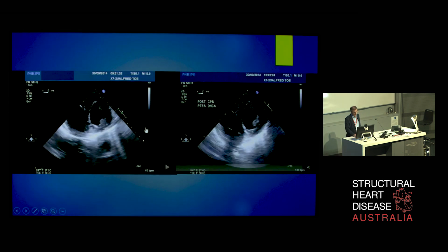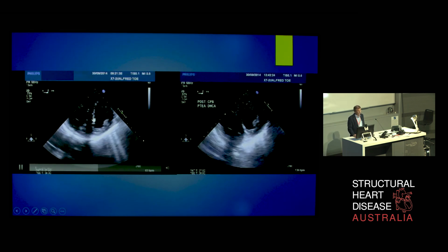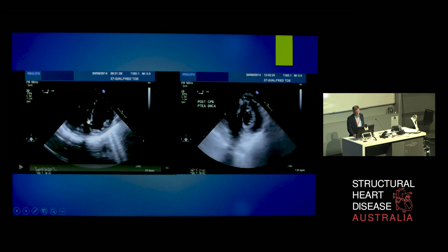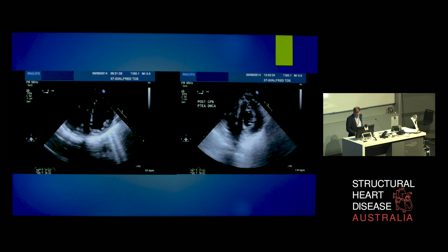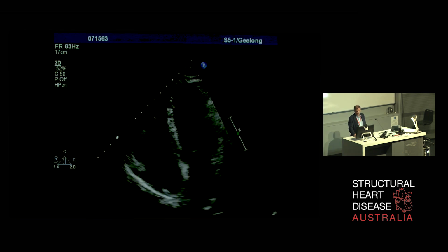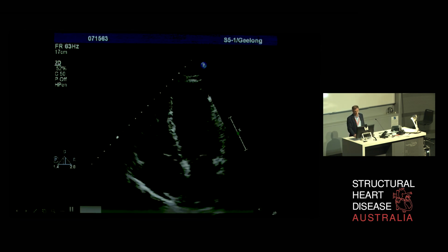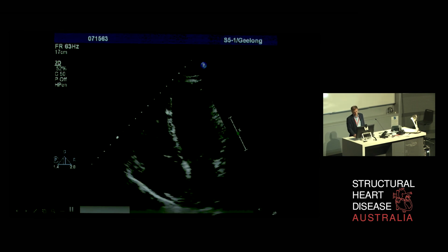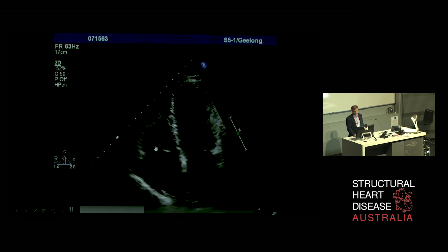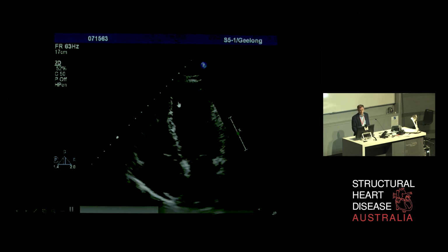And this is her echocardiogram prior to cardiopulmonary bypass. At her operation, you can see this D-shaped left ventricle because of the flat septum, and this is immediately after discontinuation of cardiopulmonary bypass. So the process of reverse remodeling of this right ventricle is already underway. And at 6 months, you can see really a normal size and shape of the left ventricle, no longer compressed, and I hope you can tell that right ventricle is now essentially normal size.